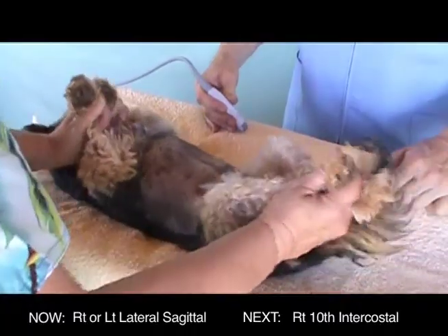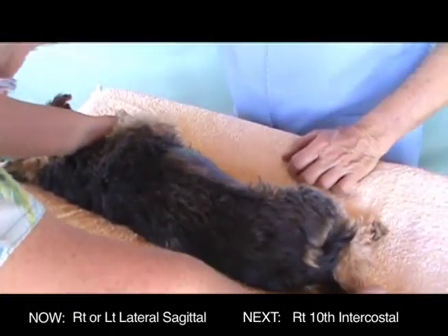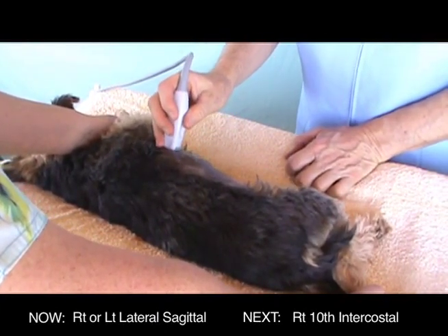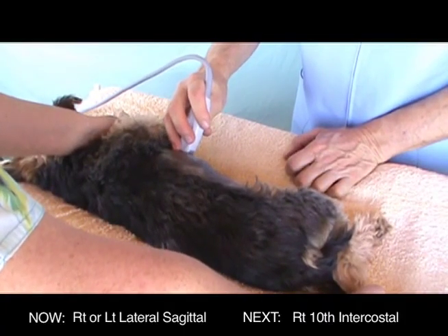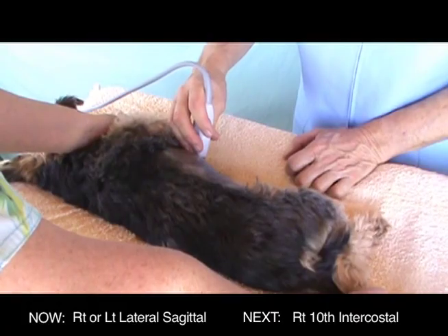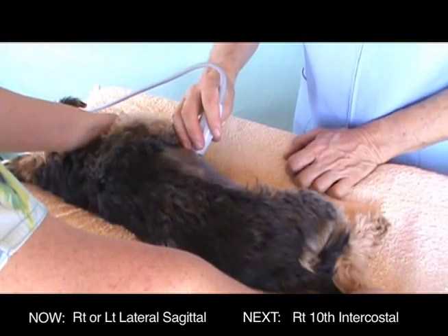For obtaining a bile sample from the gallbladder, it may be best to approach from the patient's right side between the ribs. The patient can be placed in left lateral recumbency and will need to be under anesthesia. Again, the gallbladder can be viewed from a sagittal or transverse position, but for the bile aspirate, the transducer should be placed so that the ultrasound beam is between the ribs. The needle will also be placed between the patient's ribs.